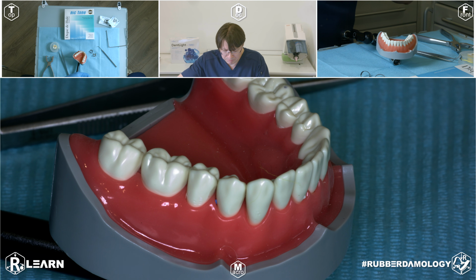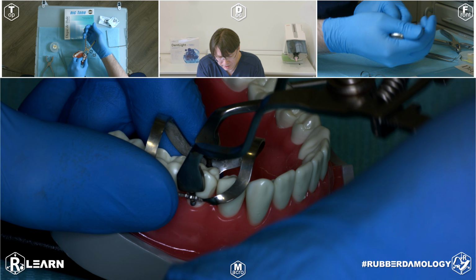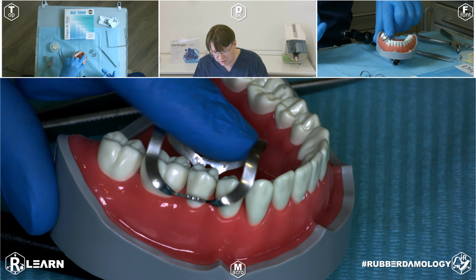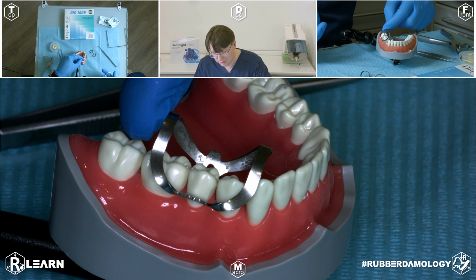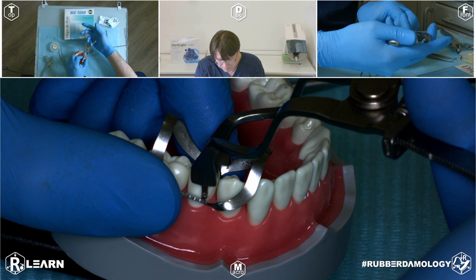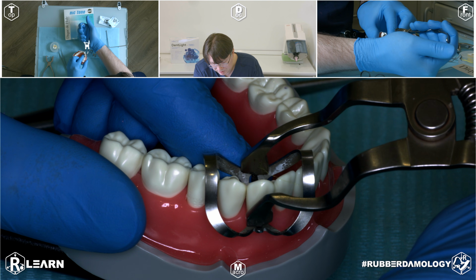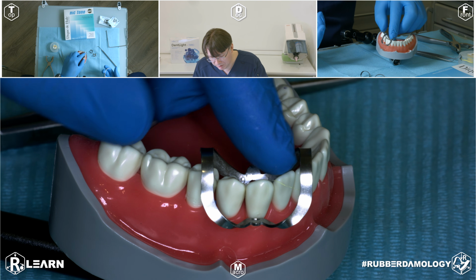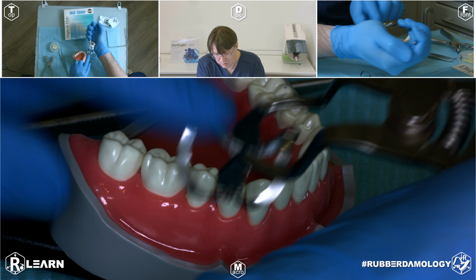this clamp number 9 with premolars. If you have no crown part of the tooth and you need additional stability because your rubber dam turns very hard, this arc outside from the mouth. Canine also, if you need a more stable position of clamp, also use this clamp number 9. Butterfly for lower jaw.